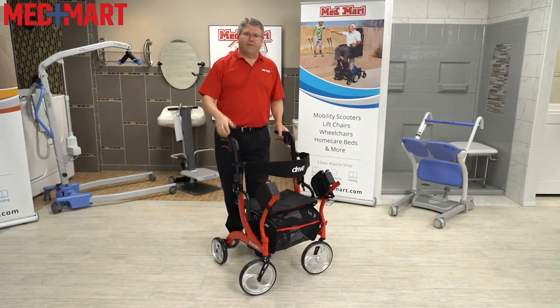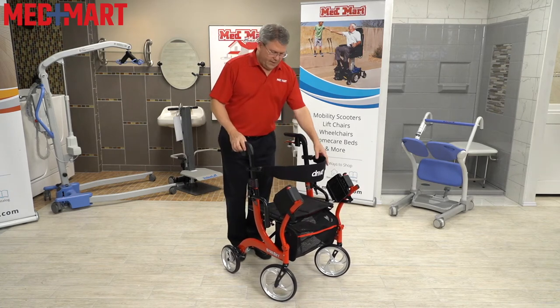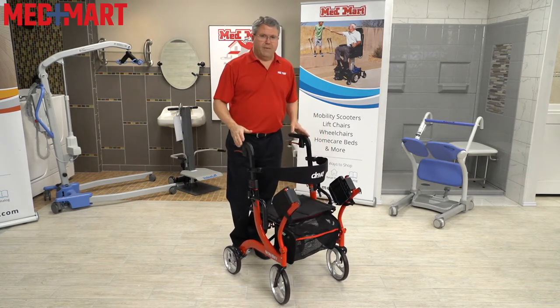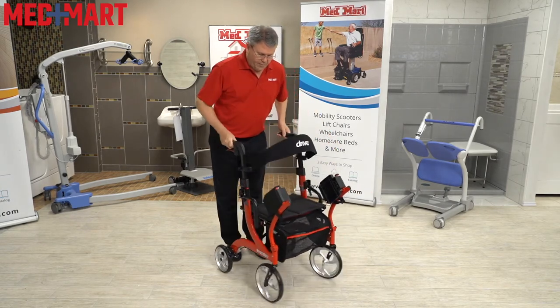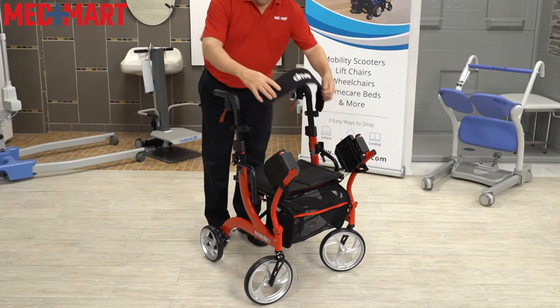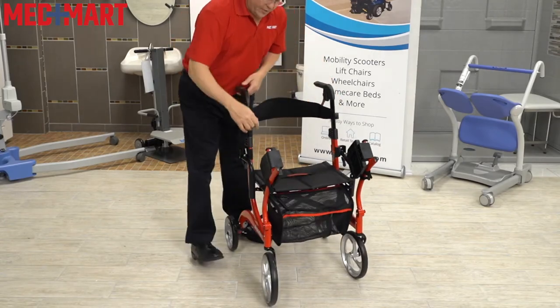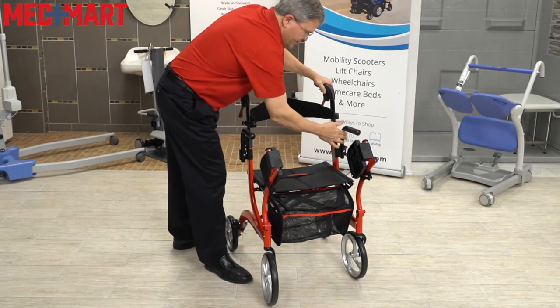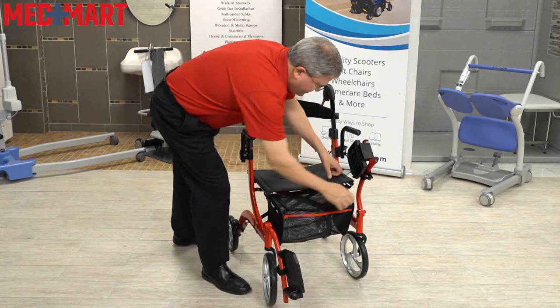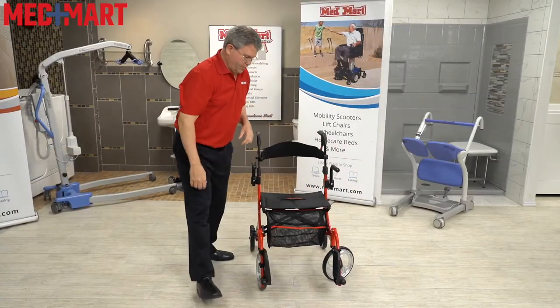So now, say you've been out for the day with your family or caregiver and you've gotten tired. This turns very easily — within a minute or less — into a transport chair. Start by putting your brakes on. The reversible backrest flips over, and that becomes the backrest for the transport chair. The armrests fold up into position. Then a push button on either side deploys the legs for the transport chair.